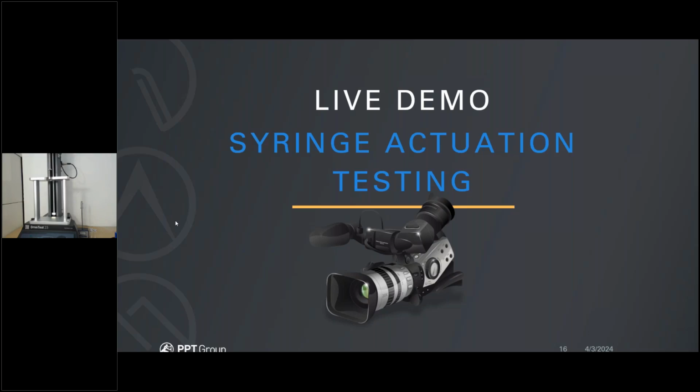And then the base fixture accommodates different types of syringes depending on the size. In our particular design, what we have is a universal base fixture, and then there are die inserts that actually accommodate the different syringe sizes depending on however many different sizes the manufacturer or the producer has to test. In this case, we created a die that fits the sample fixtures that we will be using for this particular demo.